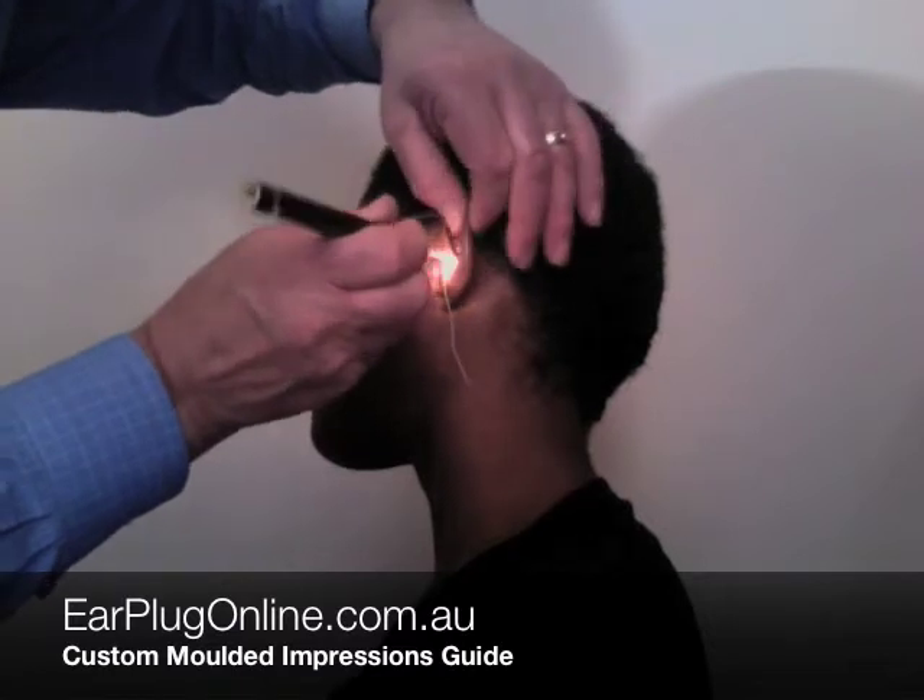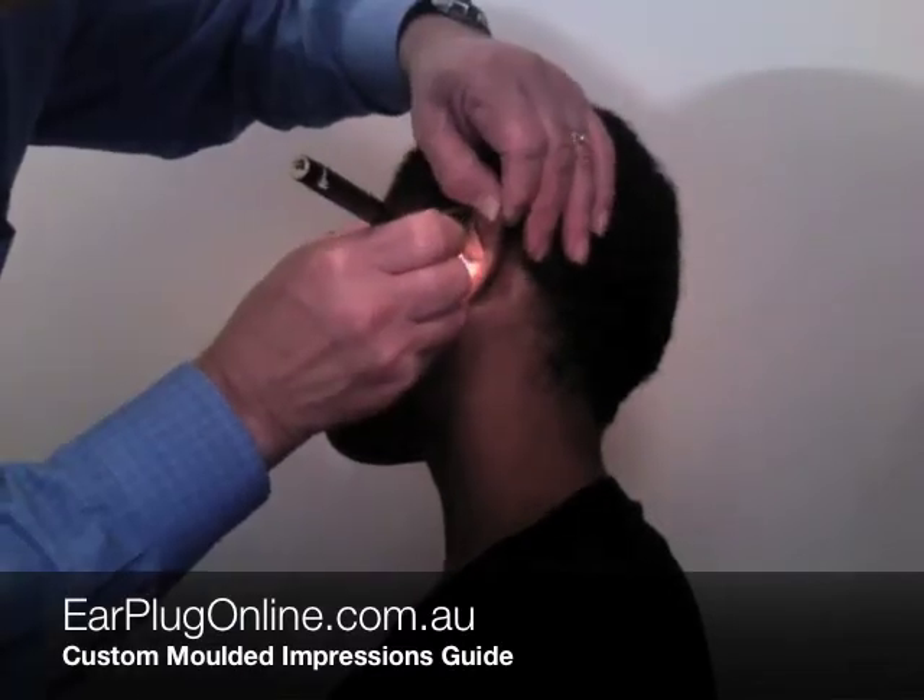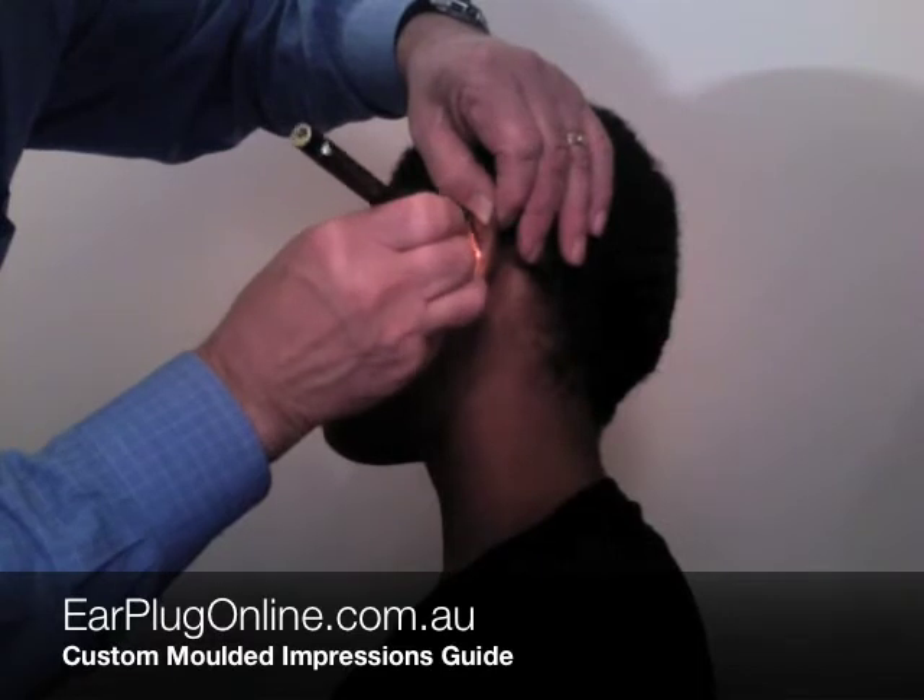A small foam or cotton oto-block is placed in the ear canal to stop the impression material from touching your eardrum.